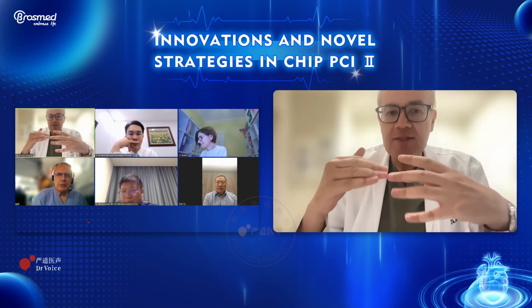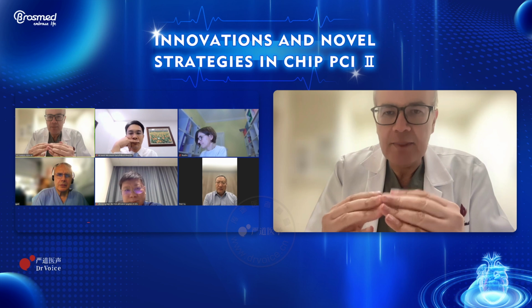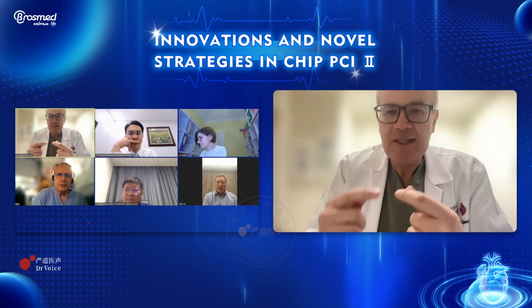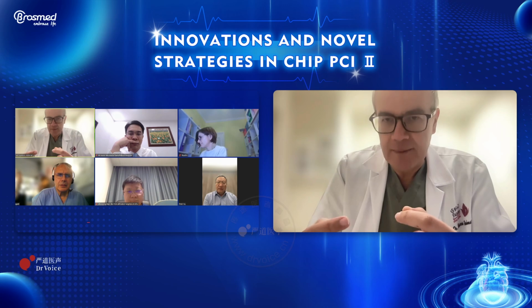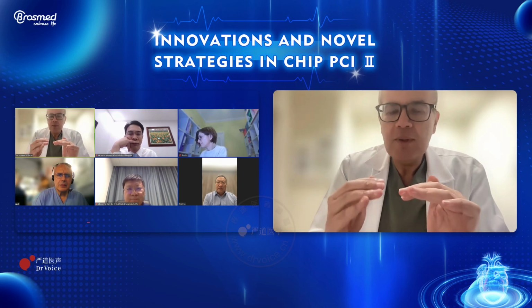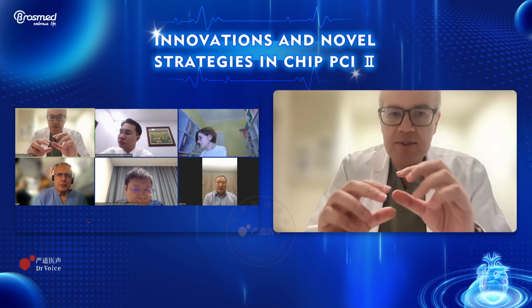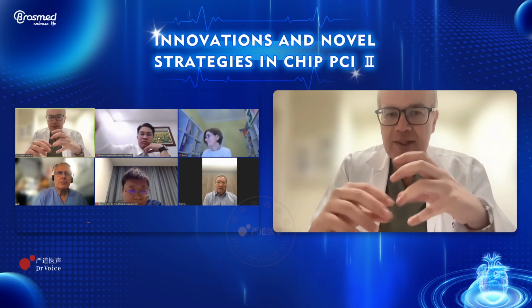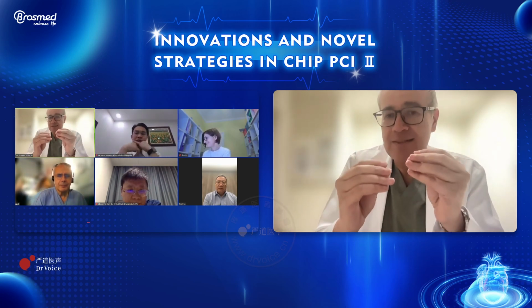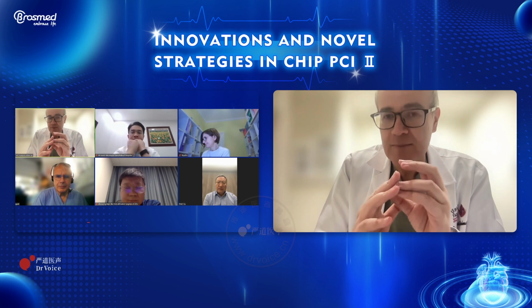Whenever you injure the plaque with the balloon, the body tends to heal, and the healing process entails the formation of a neo-intima. This neo-intima is good because we know, when we treat in-stent restenosis, that the neo-intima is slippery. If you put a regular NC balloon, it jumps. It is slippery and resistant to thrombus formation.